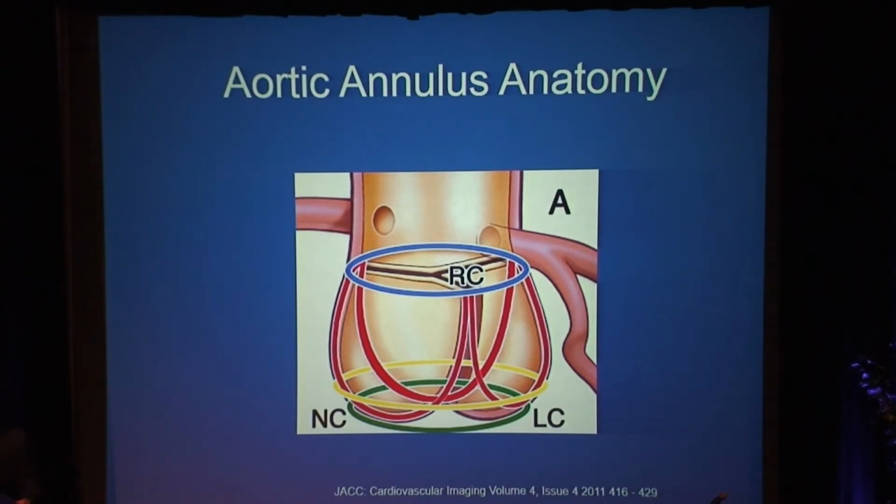Most of our imaging of the heart is done using two-dimensional echo, but for several reasons, two-dimensional echo is inadequate to image the size of the valve. One reason is that your aortic annulus is not actually a distinct anatomical structure. Unlike, say, the mitral annulus, your aortic annulus is simply a virtual plane where the anchor points of all three leaflets pass through.